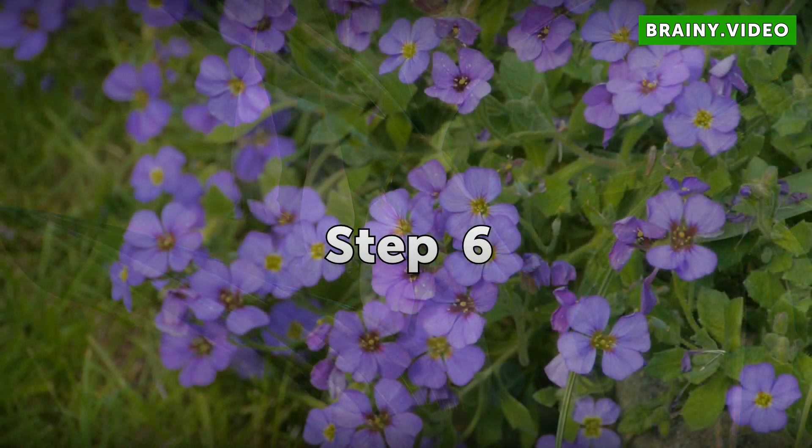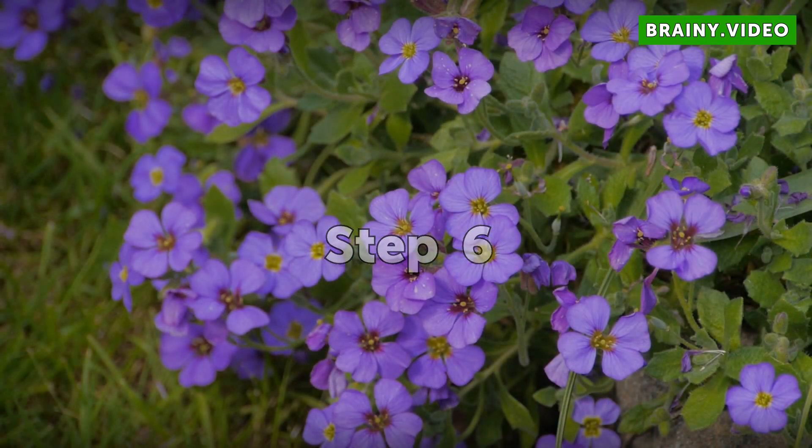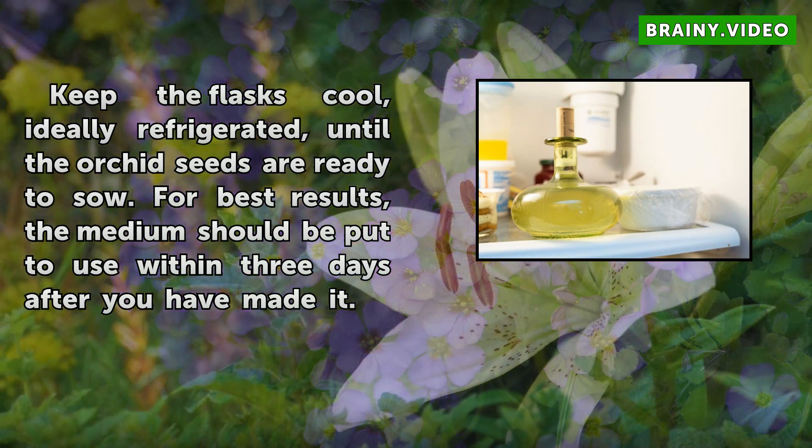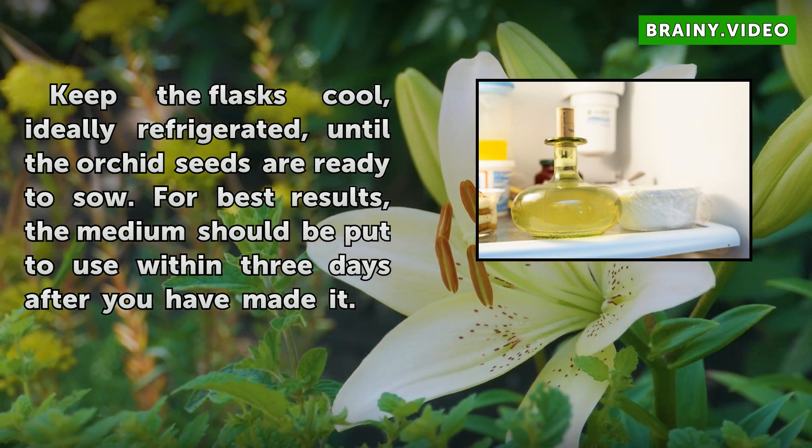Step 6. Keep the flasks cool, ideally refrigerated, until the orchid seeds are ready to sow. For best results, the medium should be put to use within three days after you have made it.